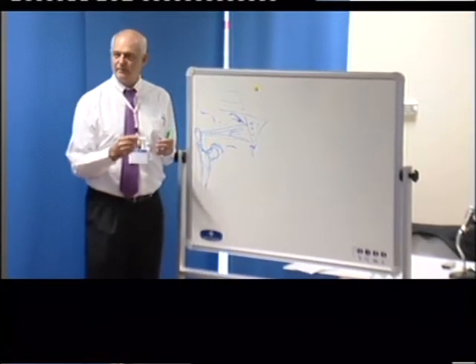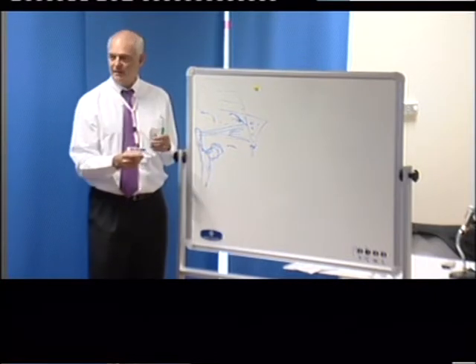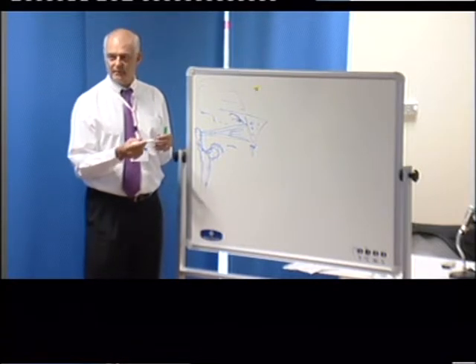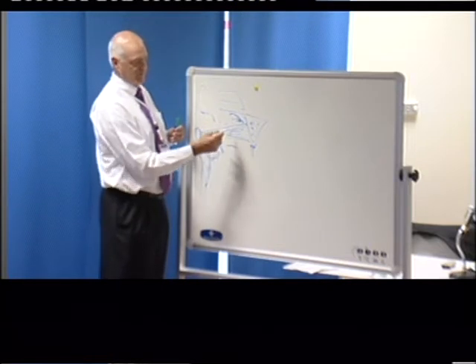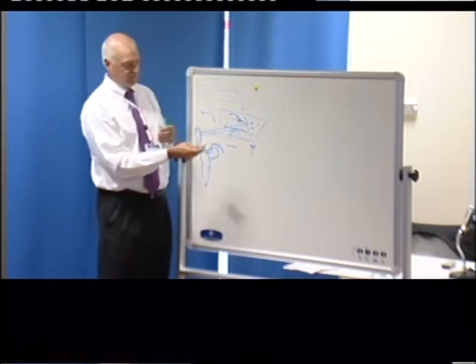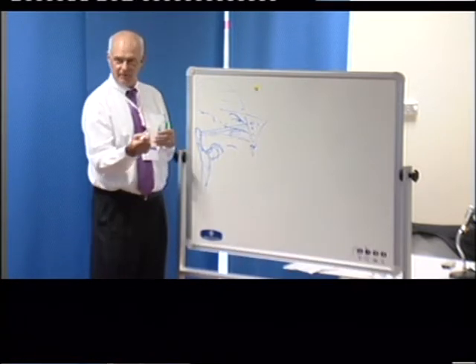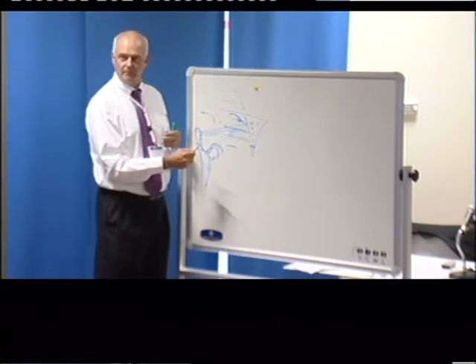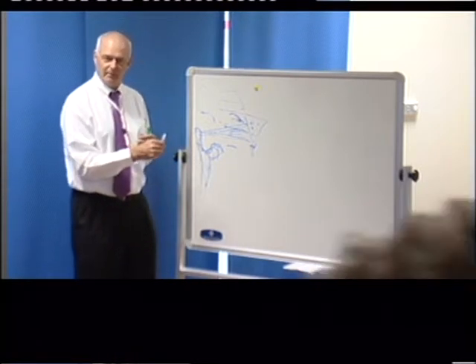I use it as my landmark, because the first thing to come out of the sciatic notch is the superior gluteal nerve and artery. So we'll look for that, and then we'll see the piriformis. We'll have the probe like this, but now we have to pivot the probe, rotate it. This is the important thing about the pelvis.